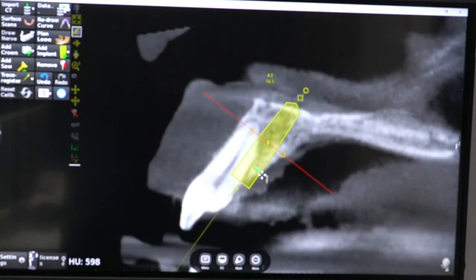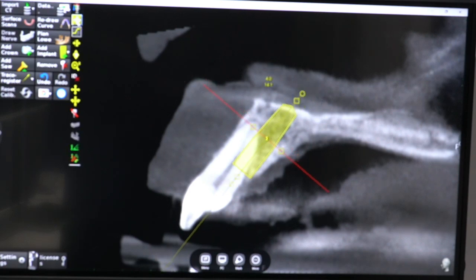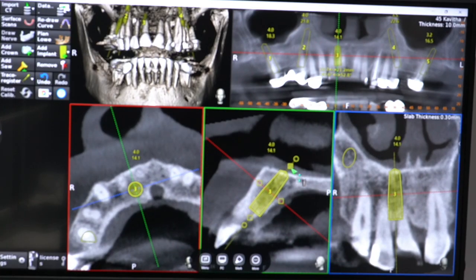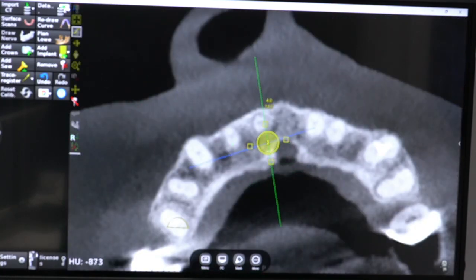So one option is to place the implant into the socket, that is one option. It is a preference, but we usually start in the interdental bone between 1-1 and 1-2. Okay, because placing an implant into the 1-1 many times encroaches the nasopalatine canal, and we tend to place two implants very close to each other.